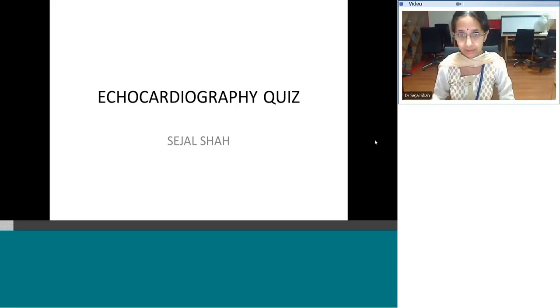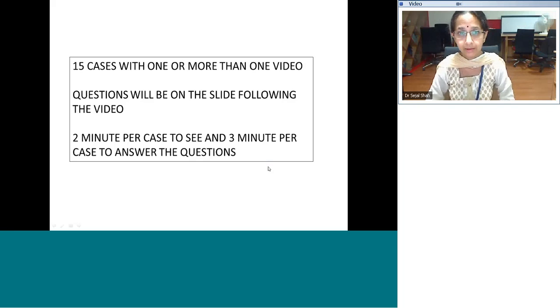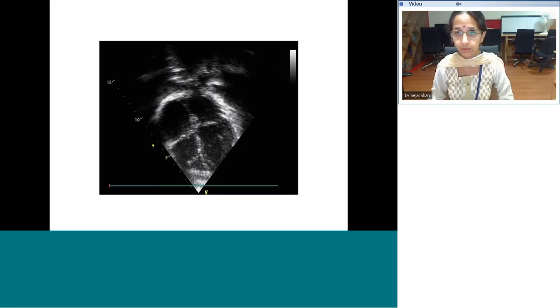So what is going to happen is we are going to have a total of 15 pictures, and there could be more than one video for every case. We will have the questions after the video is being played. So you may not understand what question is going to be asked, so see the video in general for everything. And then we will have a particular time period for every case for you to answer also. You can write your answers in the chat box, and after that we will have a short discussion on that case. So we will start with the first image.